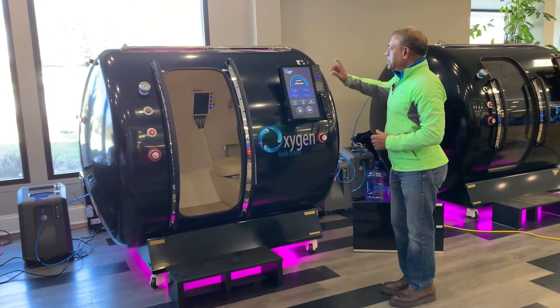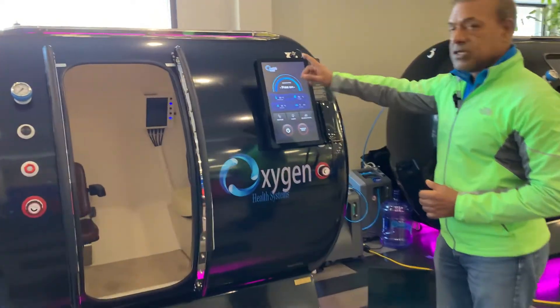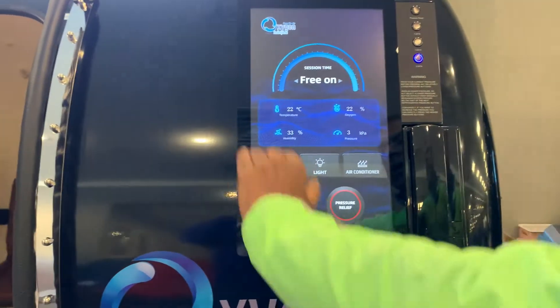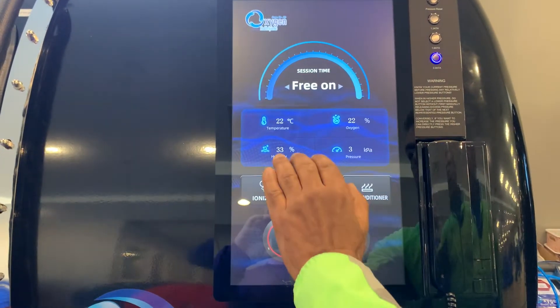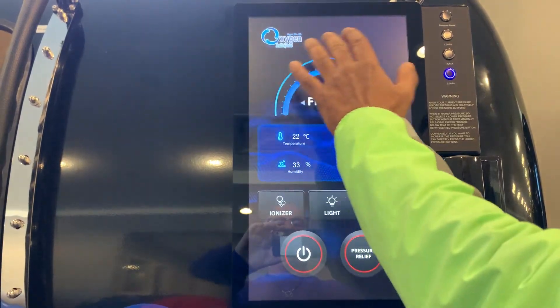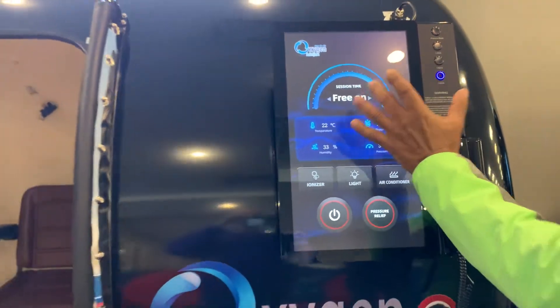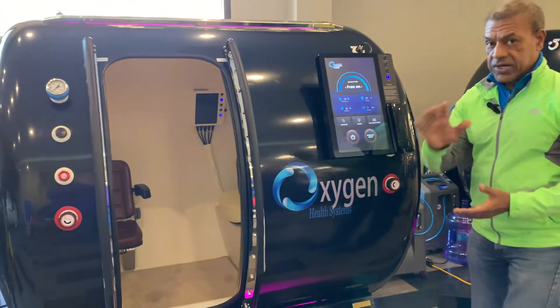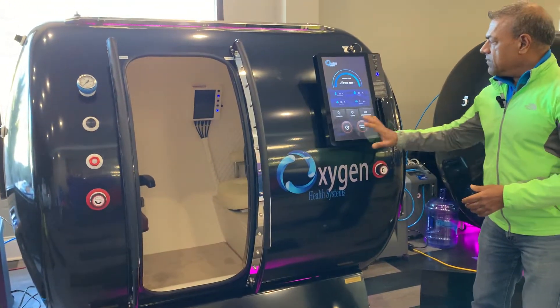Take notice that it has an incredibly large display, very easy to use — the interfaces are quite simple. You have the temperature, humidity, pressure, and so on and so forth. You can also select the time for the session duration. Very easy.